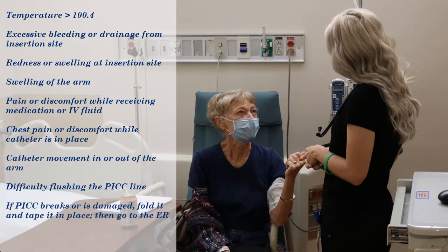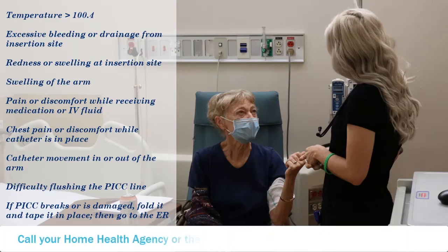If there is any damage to or breakage of the PICC, it will need to be folded and taped into place, then go directly to the emergency room. If you experience any of these symptoms, please call your home health agency or the Moffitt Patient Care Hotline at 813-745-8000.